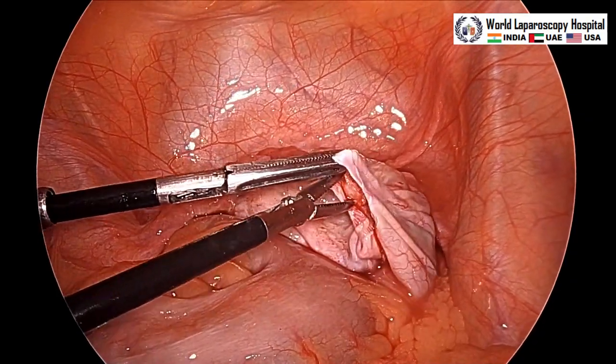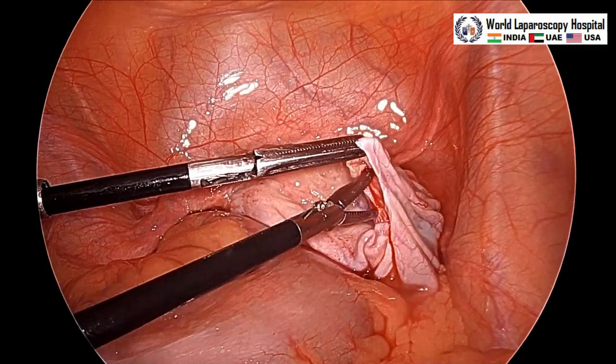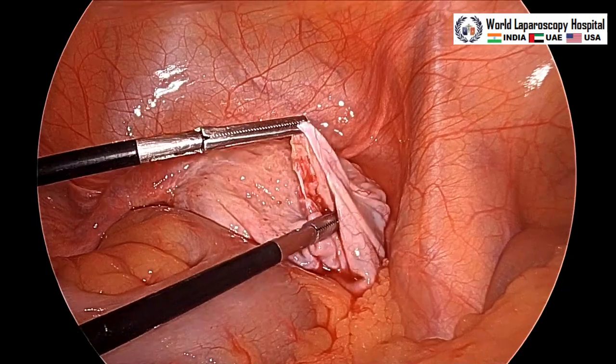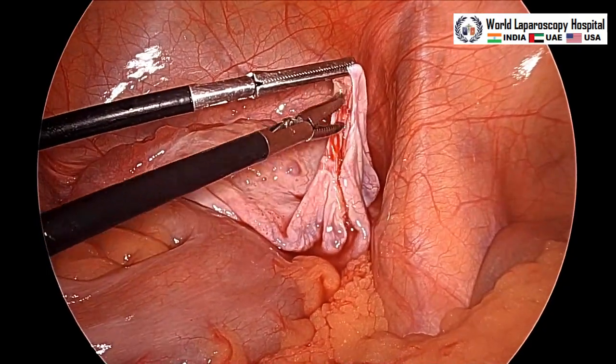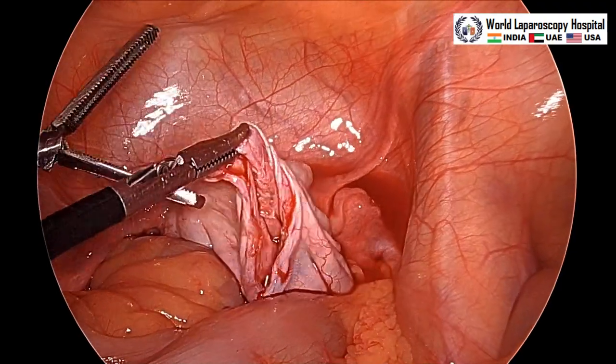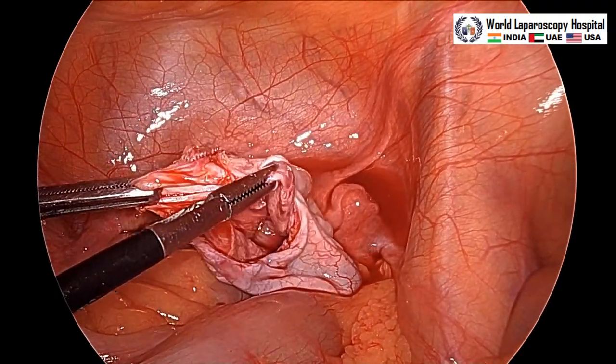The left hand has a grasper and the right hand has a Maryland, and this is the inner cystic wall which is being stripped from the outer ovarian cortex. This is a thin cyst, not thick like an endometrioma.